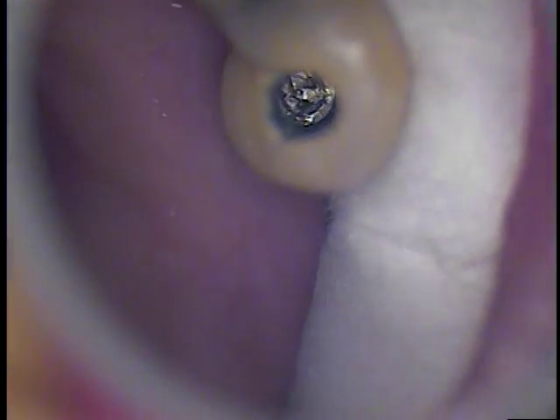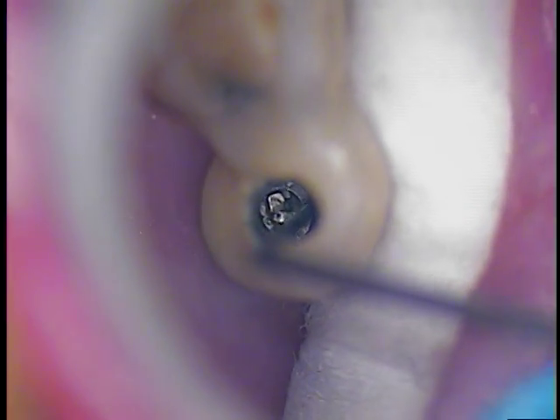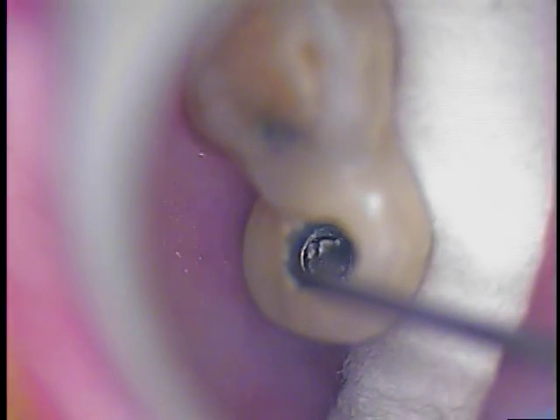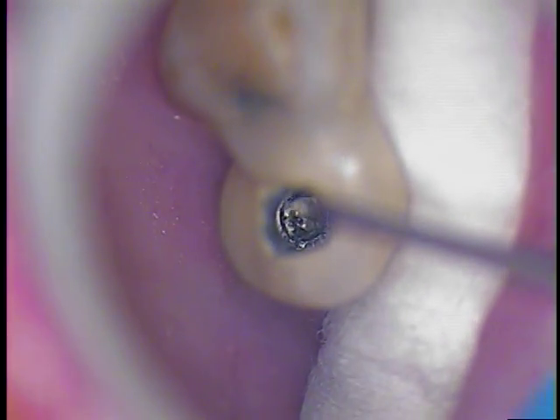I'm going to use an explorer again from the endodontist. Let's see if we've got any movement. We've got the screw moving. So, good news — at least for now, it's good news until we can get the screw out. But it is moving.